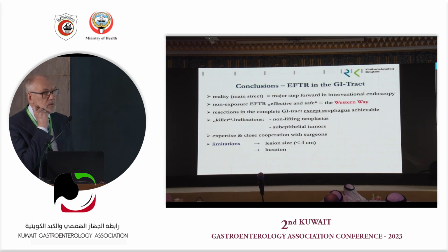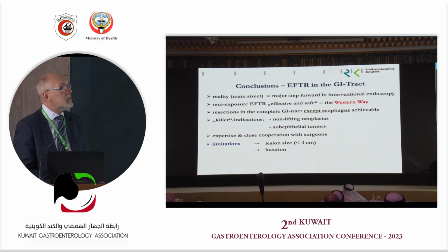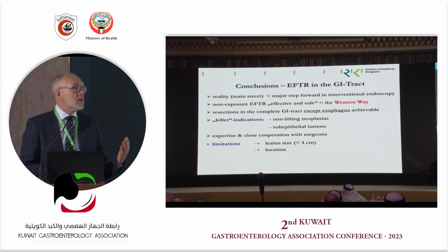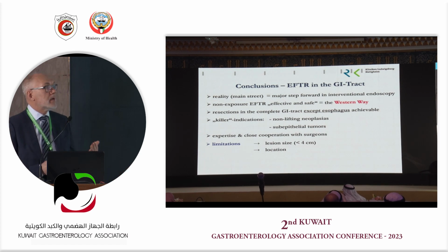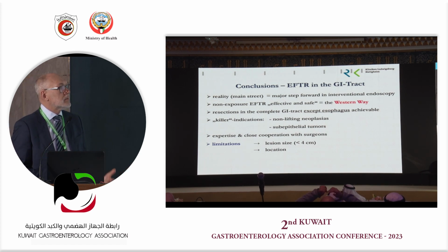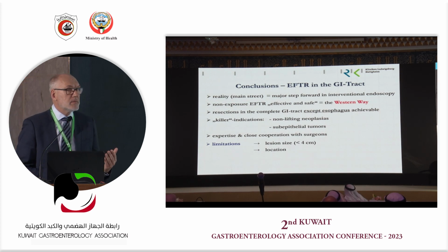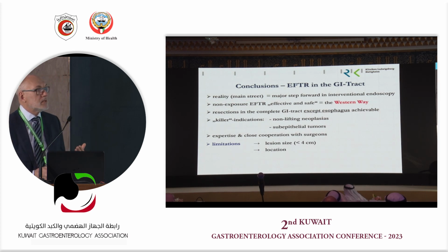So let me conclude. Endoscopic full thickness resection in the upper GI tract, it's reality, it's mainstream today. And I think it's a major step forward in interventional endoscopy. We are not limited anymore to the endoluminal resections. This non-exposure EFTR, I think it's effective and safe. So we're not risking running into problems because we're not opening the GI wall.